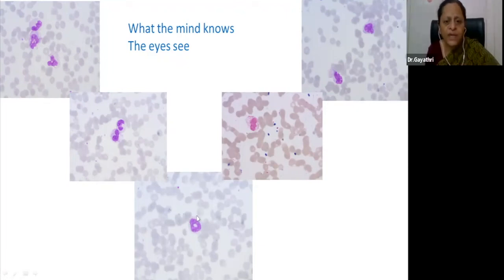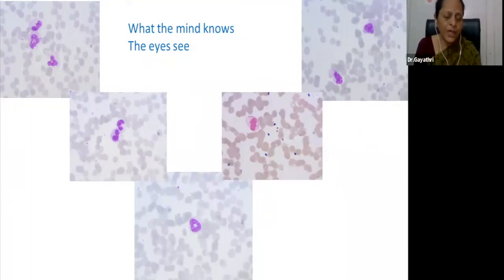All these are variations in neutrophilic nuclear morphology and also granules. Now, the granules depend on the pH of your Romanovsky stain. Do you do Leishman? Do you do Giemsa? How brightly do the granules stain in the cytoplasm, in the stain in your routine lab?